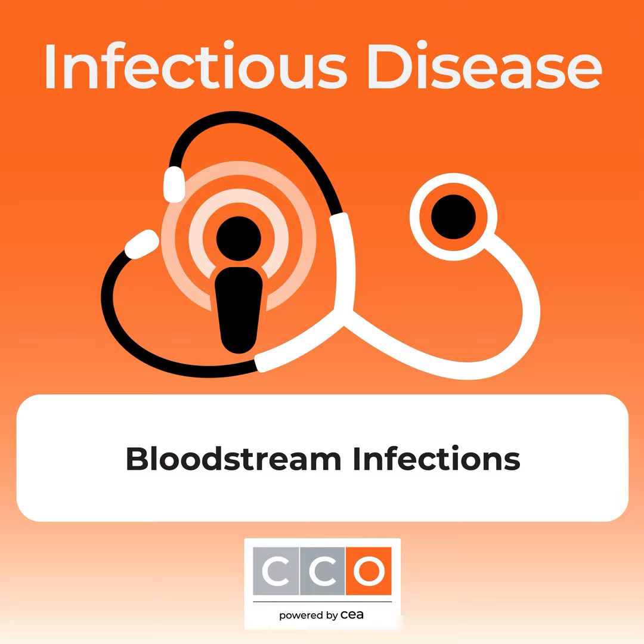Antimicrobial susceptibility testing is performed by exposing the bacteria to a panel of antibiotics and observing if growth is inhibited. And in most laboratories in the US, this is done with automatic instrumentation. There are additional manual techniques such as gradient strips or disc diffusion that might be required to confirm some results for antibiotics not available on our standardized assay panels for our automated systems.